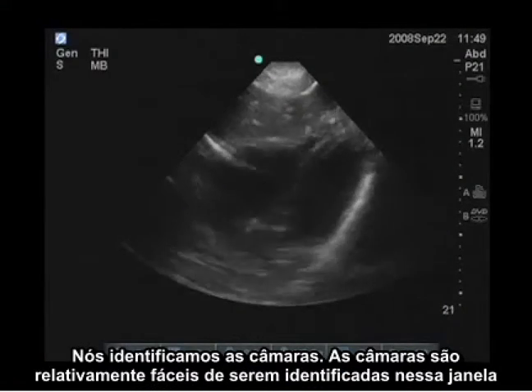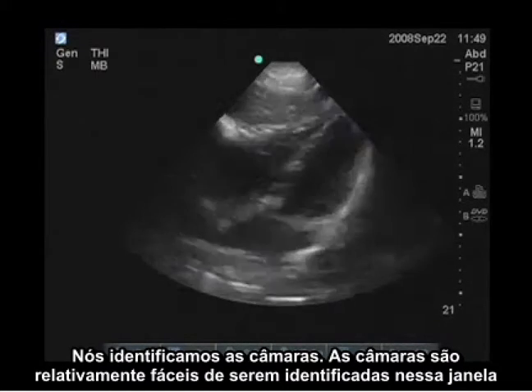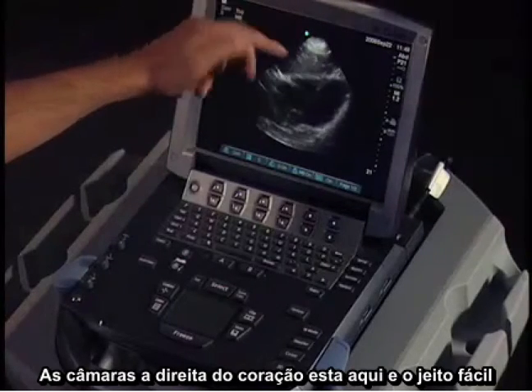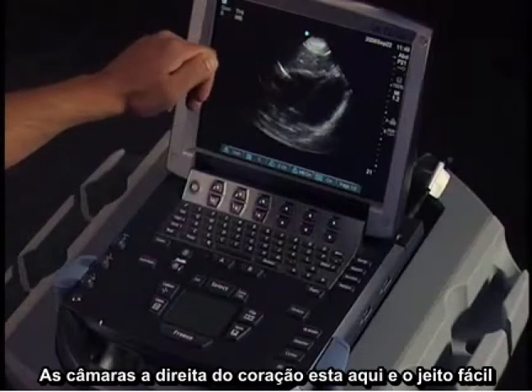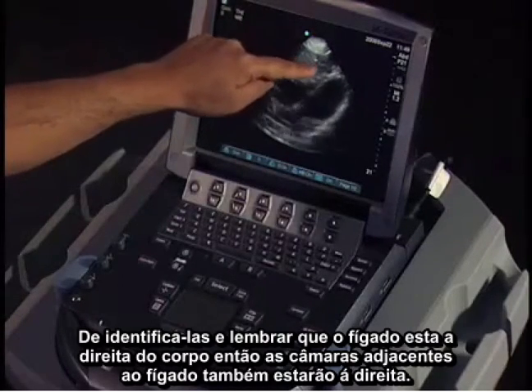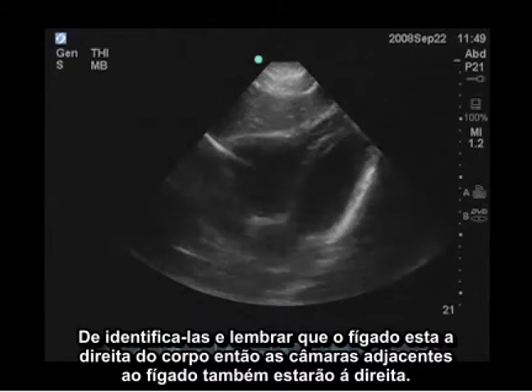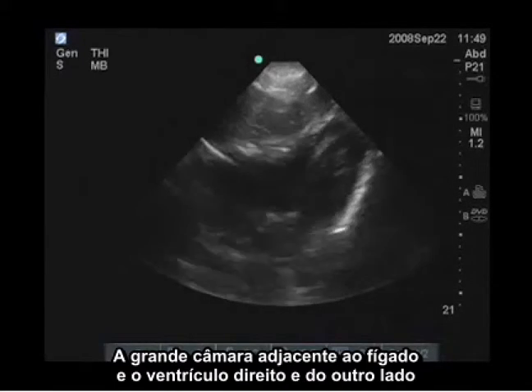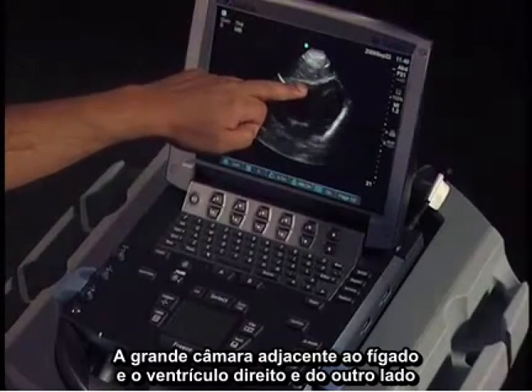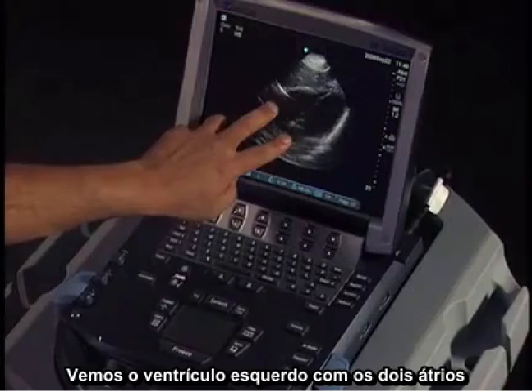Then we can identify the chambers, which are relatively easy to identify in this view. The chambers on the right side of the heart are over here. Remember, the liver is on the right side of the body, so the chambers adjacent to the liver are right-sided chambers. The large chamber adjacent to the liver is the right ventricle. On the other side, we see the left ventricle and the two atria.